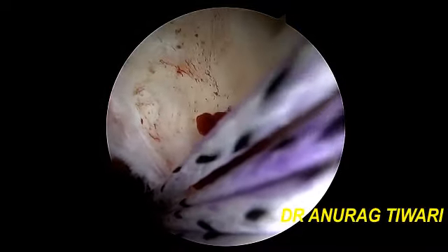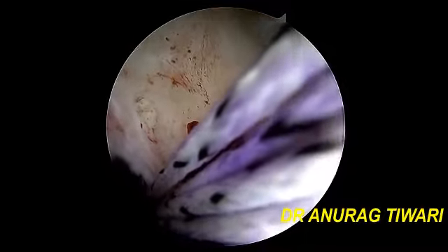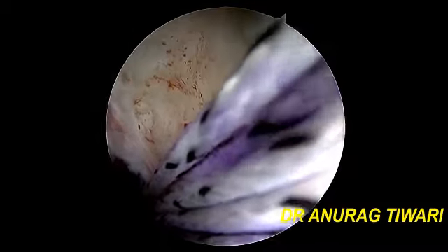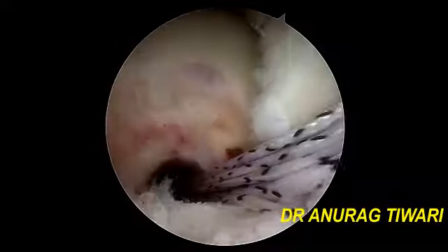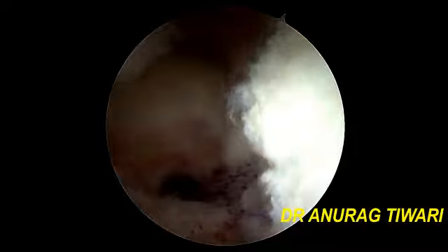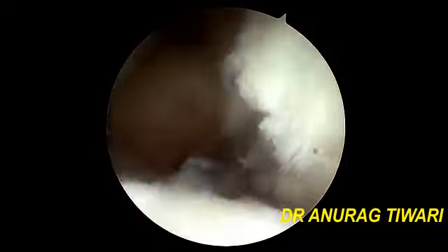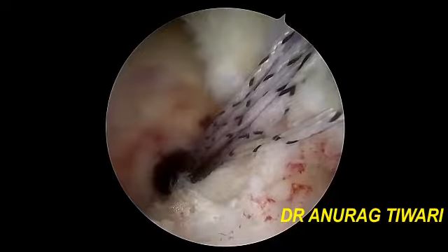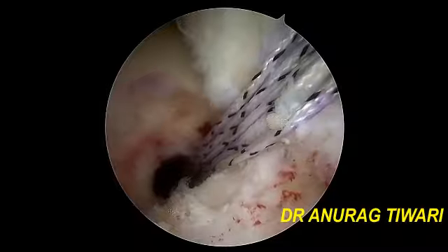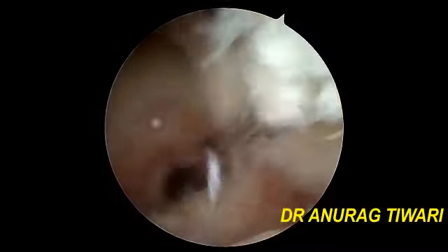Now when you pull the adjustable threads over this endo button, the graft will be pulled into the femoral socket.